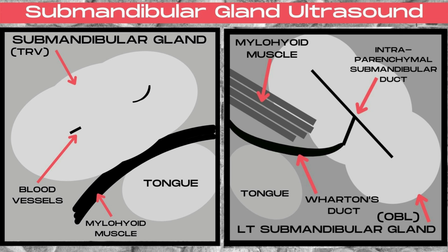You commonly can see little pieces of blood vessels within the middle of the gland. The myelohyoid muscle is going to be inferior to the gland, with the hyperechoic tongue below that. The image to the right is an oblique representation of the submandibular gland, and this is the plane that you want to get in order to try to visualize Wharton's duct, which would be located below the myelohyoid muscle and anterior to the tongue on ultrasound.